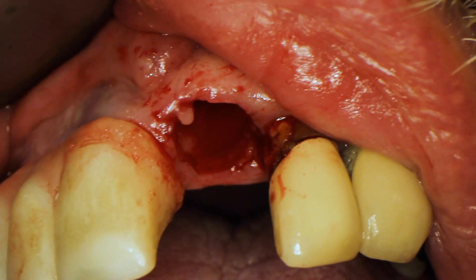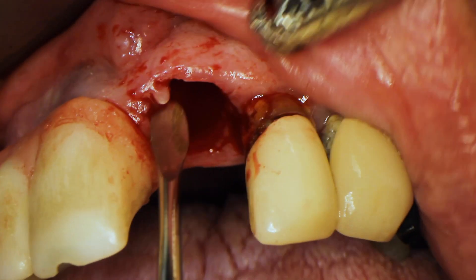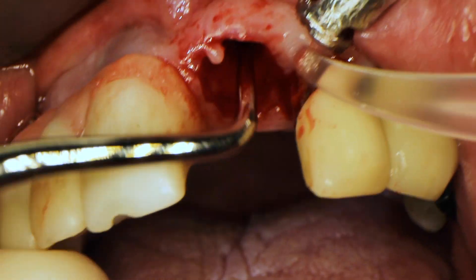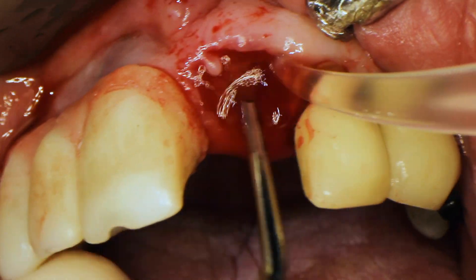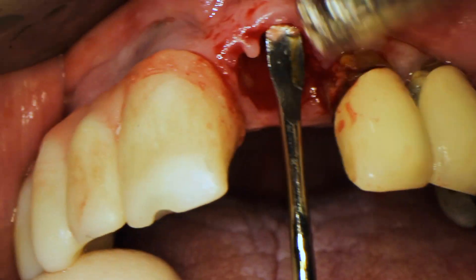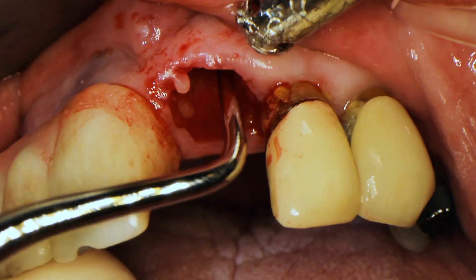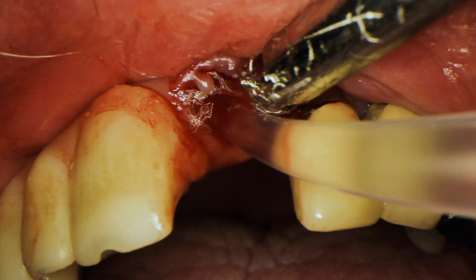Now I'm going to debride the socket — I'll irrigate with saline to make sure it's really clean, no infected periapical tissue or granulation tissue is left. I also use this time to check if there's any dehiscence in the buccal wall — checking for a little window of communication between the socket and the outside tissue.